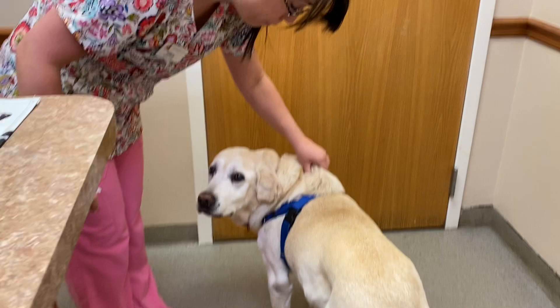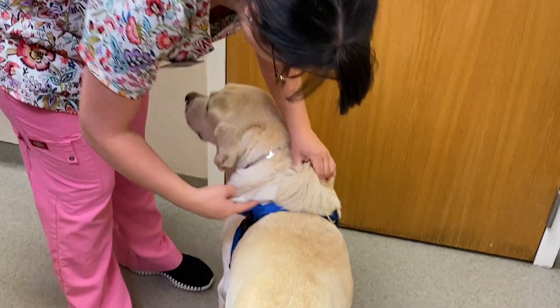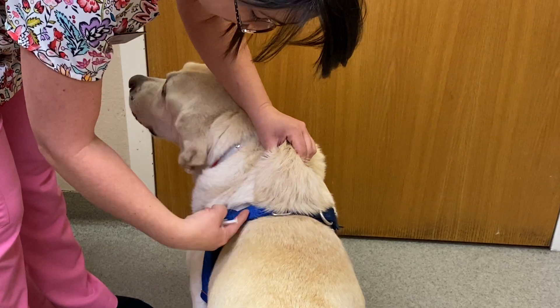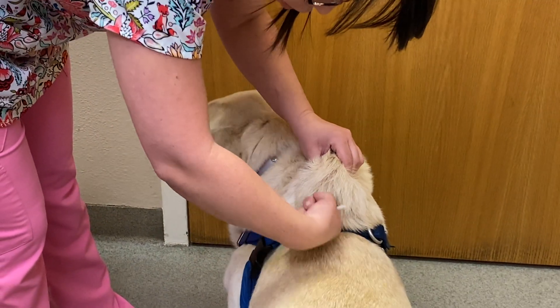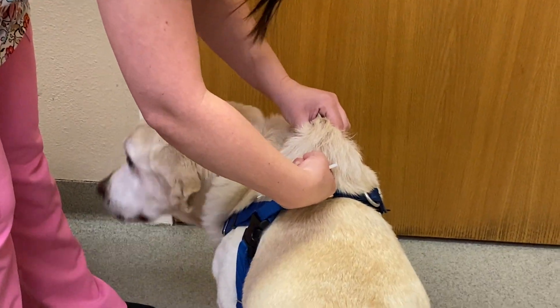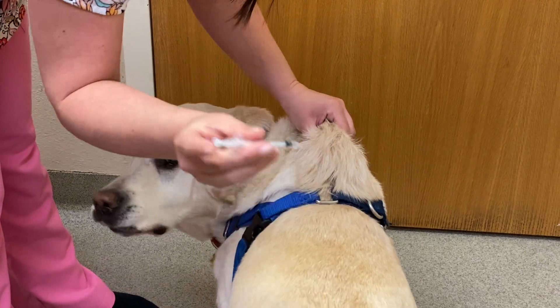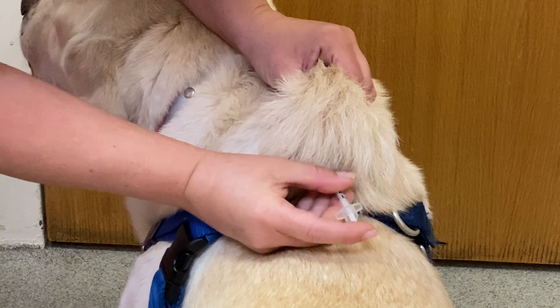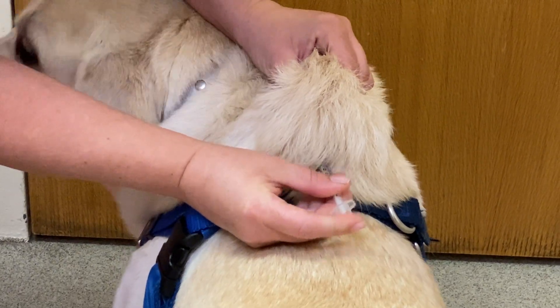This is a great place to pinch up skin. When you pinch up the skin here, it doesn't hurt your dog and you get a nice little pocket. If you stick your finger in there, you'll feel exactly where you want to go. I've got my finger on the plunger ready to go, and I'm going to stick the needle in until I feel it stop.